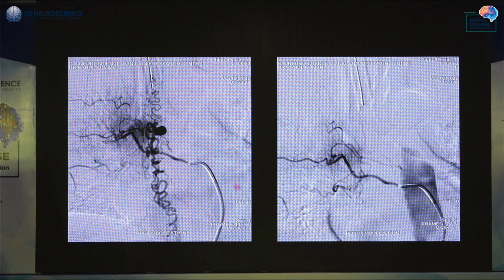This was the pre-procedure injection. This is the post-procedure injection. You can see multiple intersegmental anastomosis. You can see a radicular artery, intersegmental anastomosis going back into the aorta, refluxing into the aorta, and then you can see these multiple vessels, but there is no fistula.